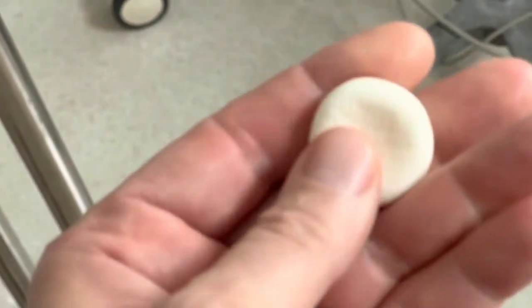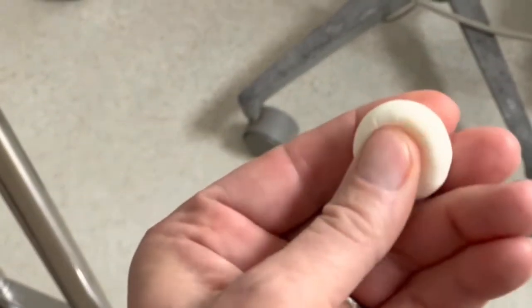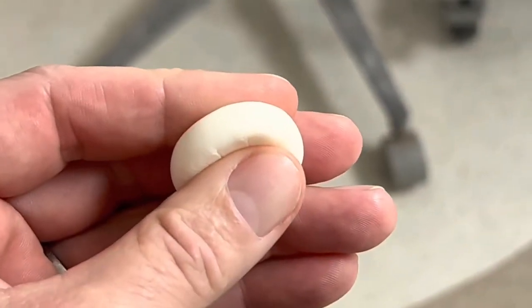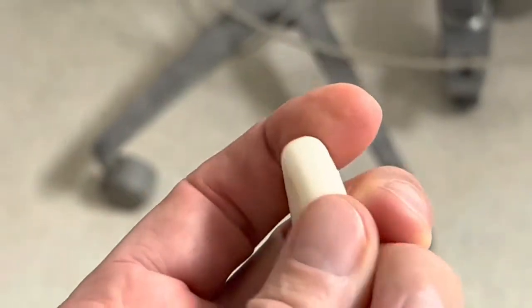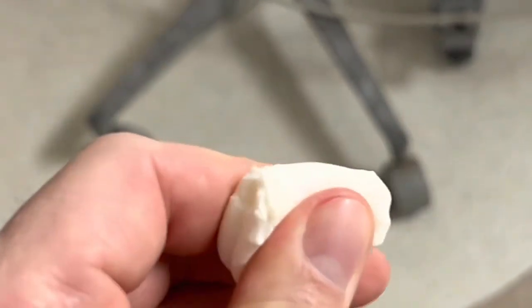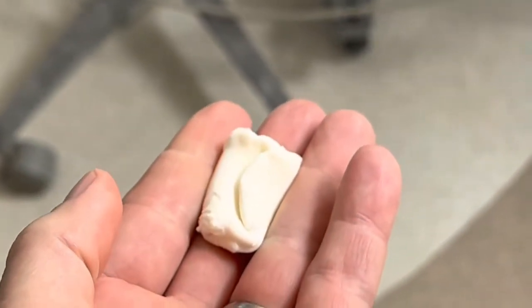Well, I'm anxious — we're going to find out. So right now we're looking at this right here, which is kind of interesting. This is some of the cement. Now this is the same batch that we put in Mrs. M. It's getting firm now. It's just a little extra we had and we hold onto this. When it starts getting hard, it's when we allow her to get off the table. It's squishy right now, but it's going to harden up. I put about almost that much inside. Really? Yes.